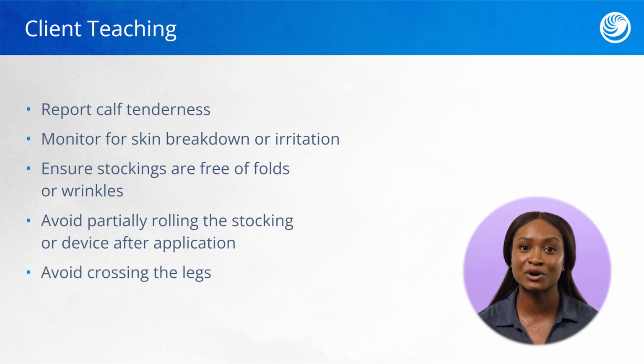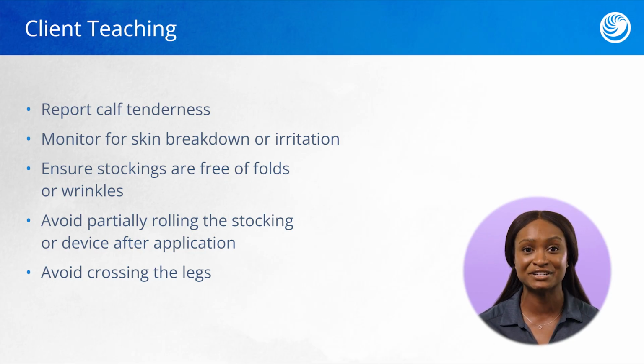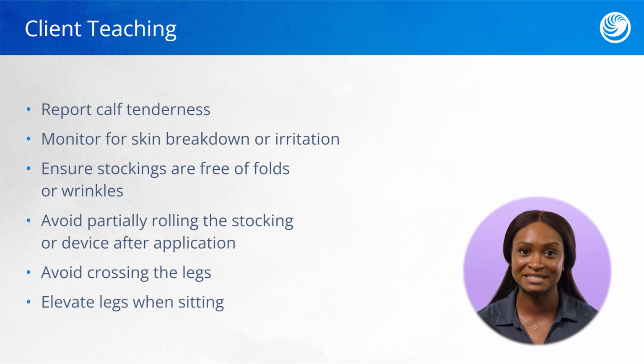Instruct the client to avoid crossing the legs. This increases pressure at the touching points and decreases venous return. You can encourage the client to elevate their legs when sitting because this stimulates blood flow back to the heart.